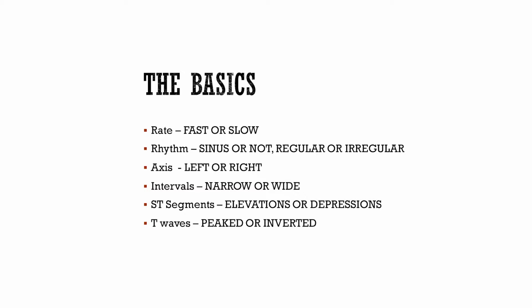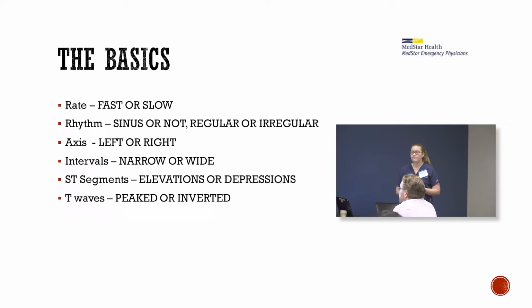So I like to approach EKGs the same way every time. When you get to a really tough EKG that you don't know what to do with, it's nice to be able to fall back on a very specific interpretation strategy. So I look at the rate, the rhythm, the axis, the intervals, ST segments, and then the T waves.